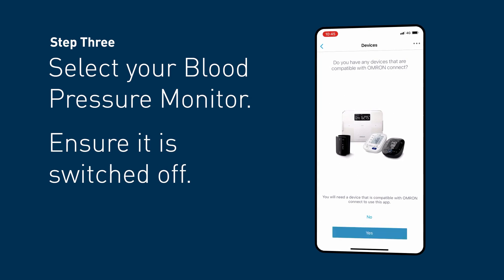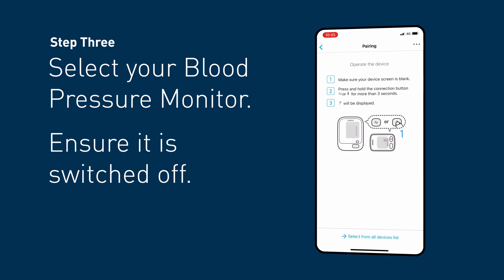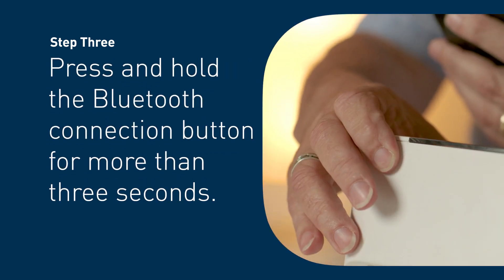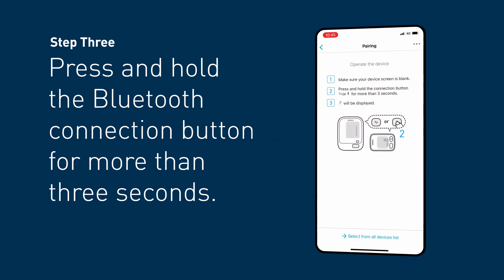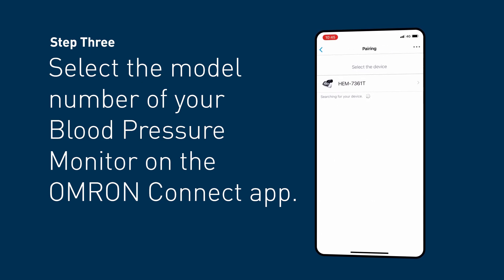Step 3. Select your blood pressure monitor. Ensure your blood pressure monitor is switched off. Press and hold the Bluetooth connection button for more than 3 seconds. Select the model number of your blood pressure monitor on the OMRON Connect app.